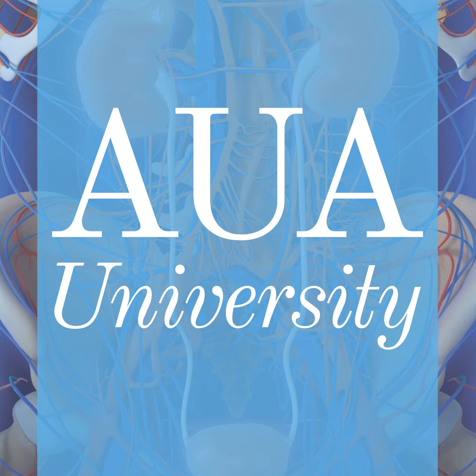So our policy right now is we start usually with a gallium PSMA PET scan if we want to look for systemic metastases or if we monitor patients under active treatment. If, however, we have the suspicion that patients might have a local relapse after radical prostatectomy or after radiation therapy, we use the F18-1007 tracer to be sure that we can identify the most likely spot.